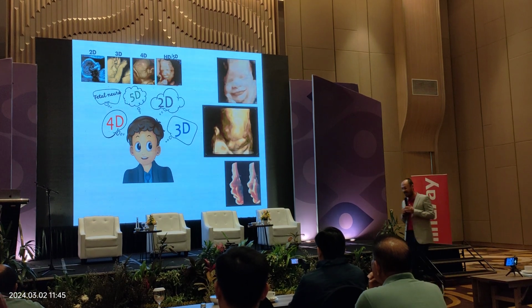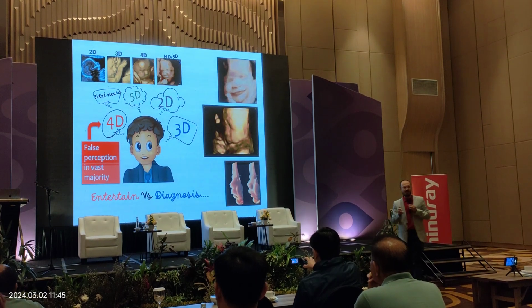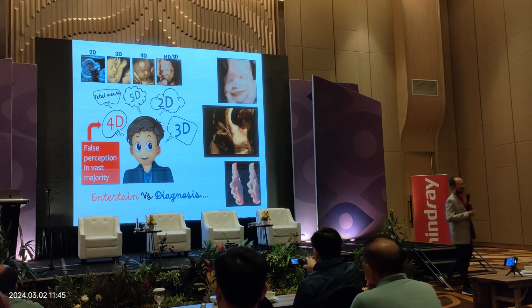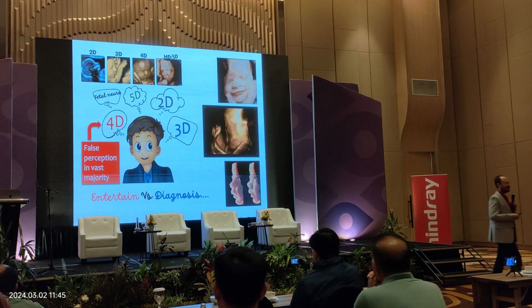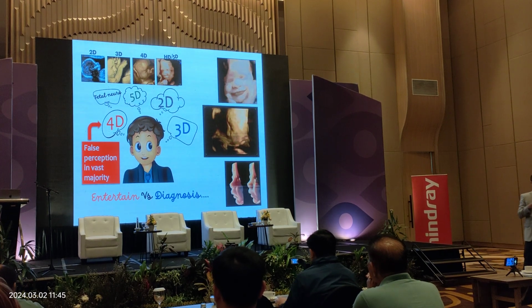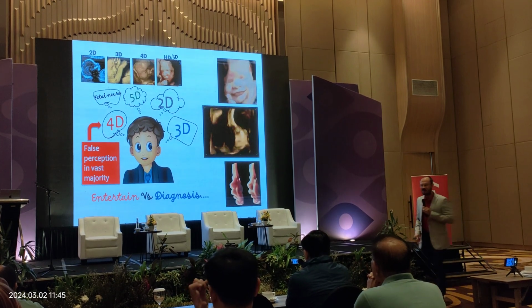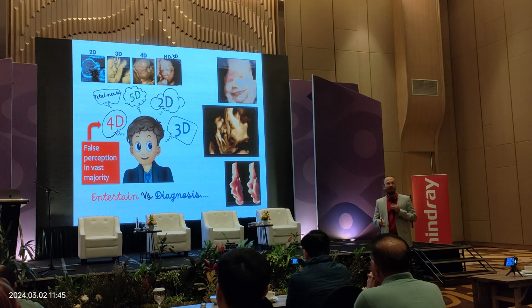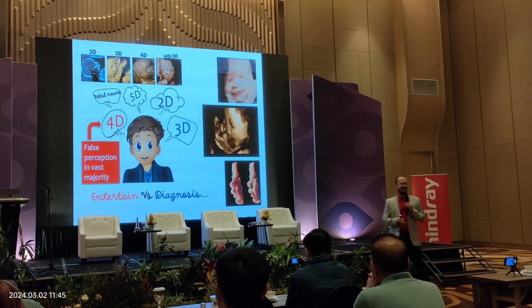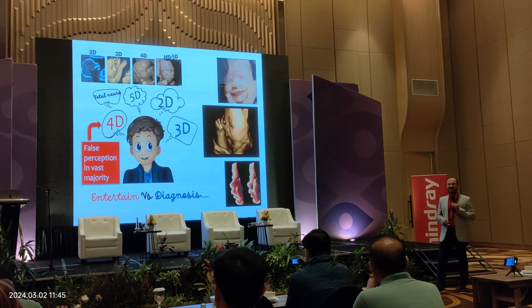So I think it is very clear to us that the vast majority of people, not only outside the medical field but also our colleagues, are still very confused about what is 3D, what is 4D, and what is 5D. And also the patients. Patients are always asking to do 4D.